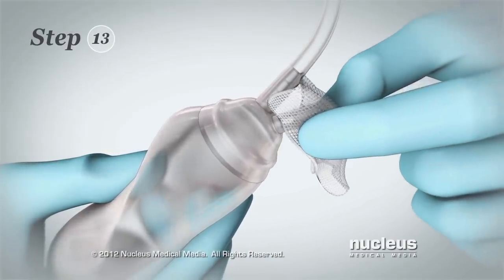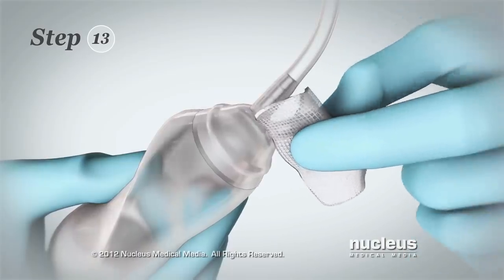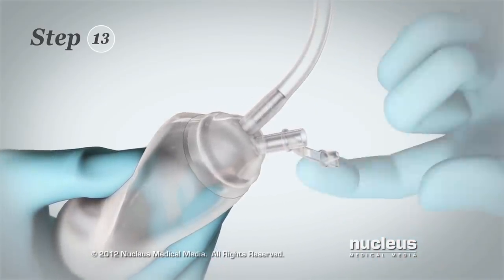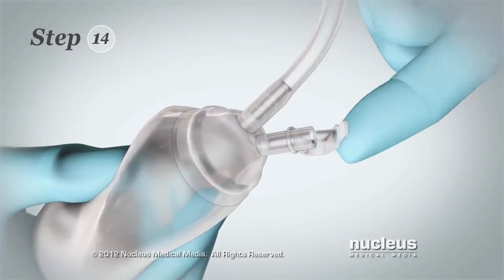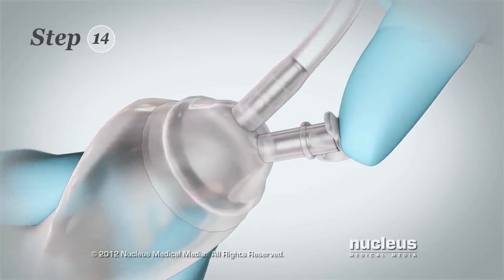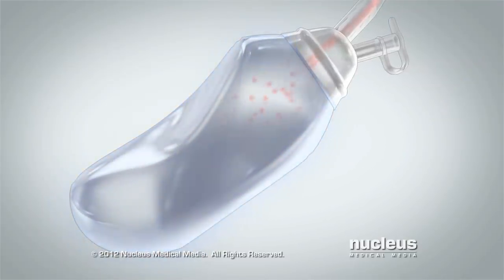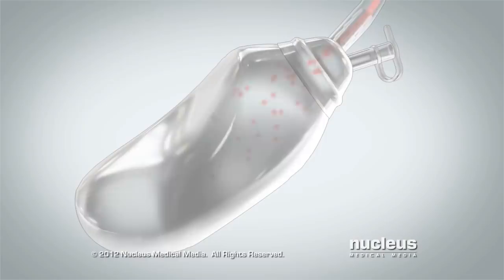Step 13: After removing the fluid, continue squeezing the bulb and use a new alcohol wipe to clean the top. Step 14: While still squeezing the bulb, put the cap back on the top. The depressed bulb creates suction that continuously removes fluid from underneath your skin.